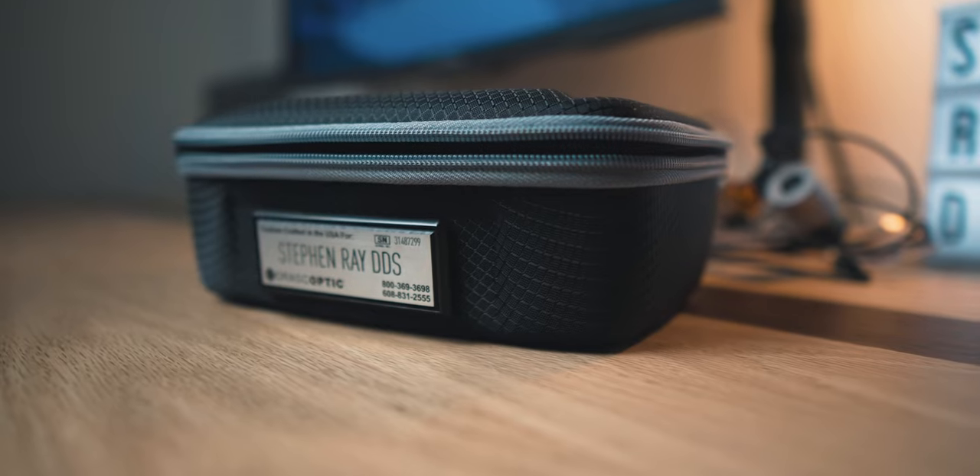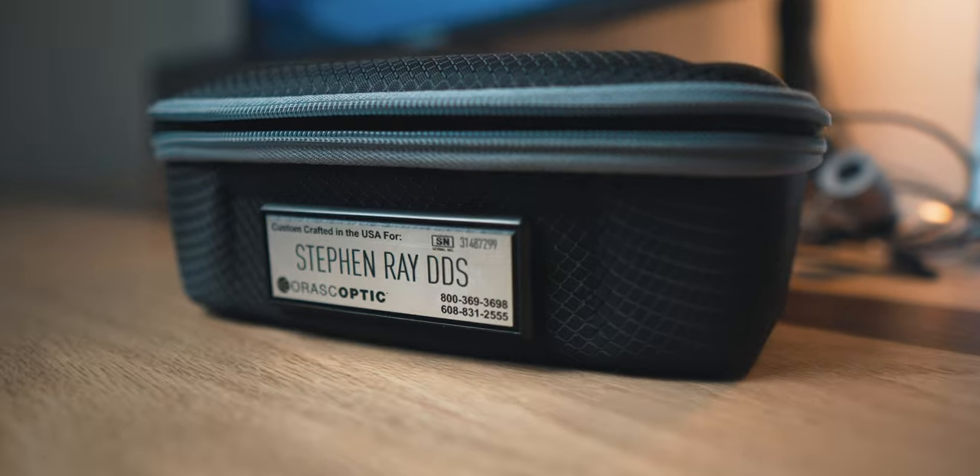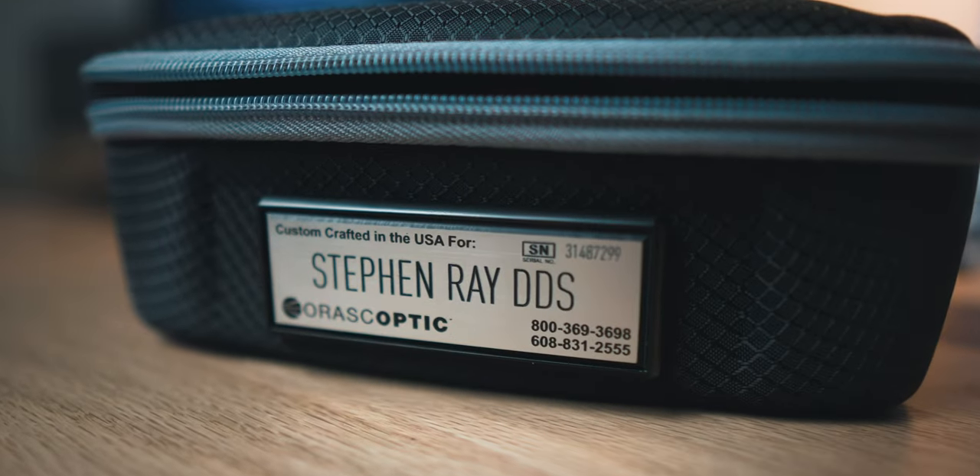I just wanted to point out this amazing case that Orascoptic does for the loops. This is the individual case for the loops themselves, and then there is a larger briefcase-style case with the same overall style. They give you this engraving so you get to see your name done up on it — it's pretty sweet.